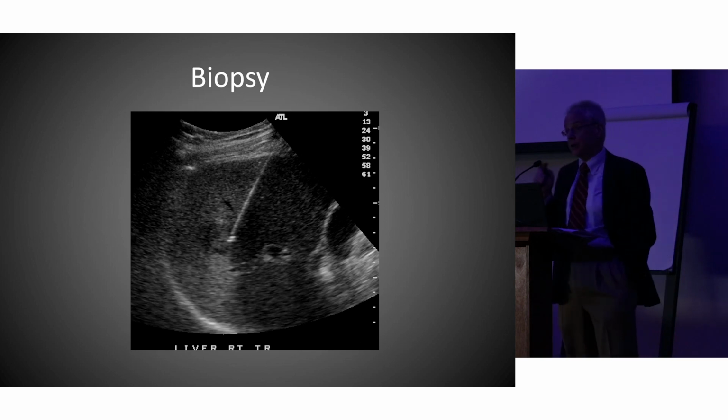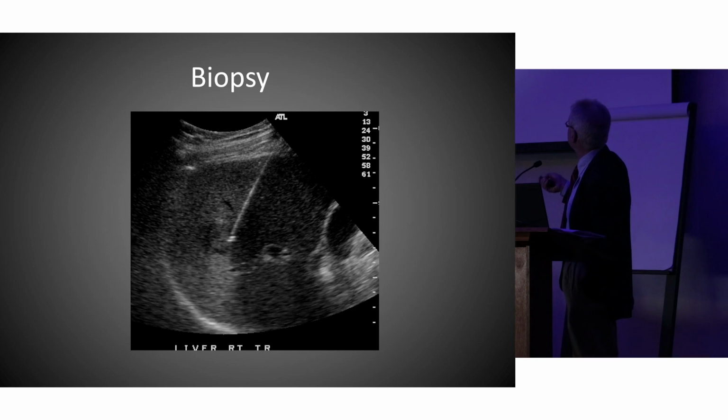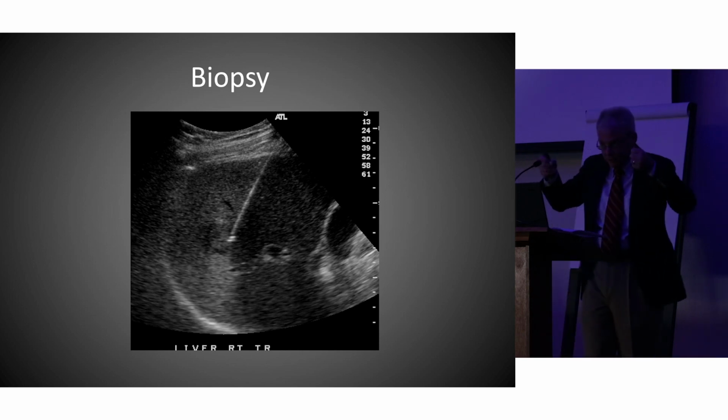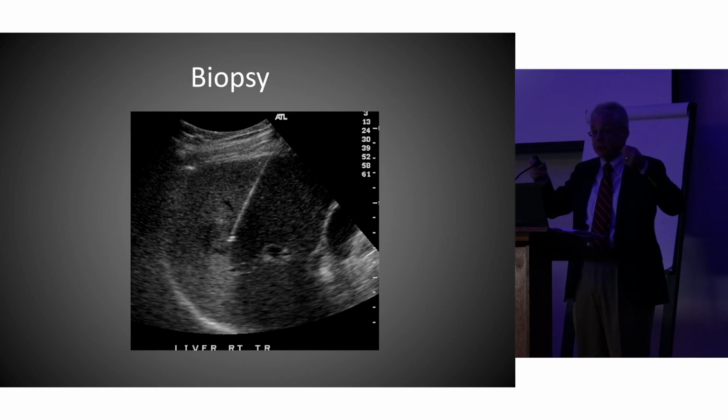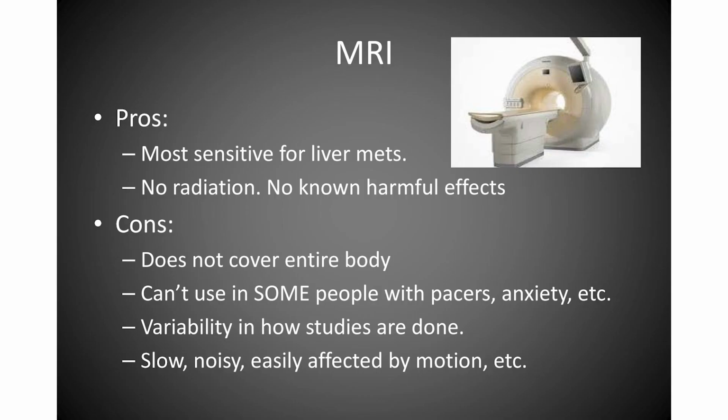Ultrasound can be very helpful for biopsying. And if the room were totally dark, because remember, radiologists read in little dark rooms because ambient light is not our friend, but if the room were dark, right there is a tumor.